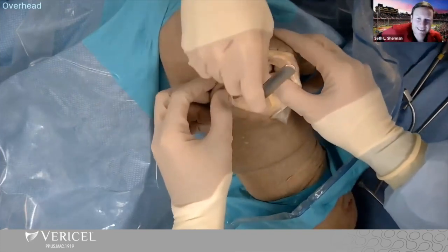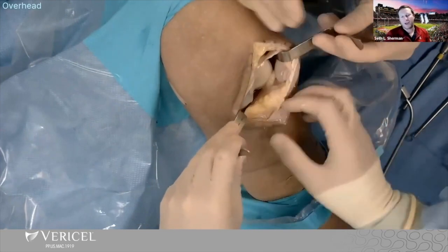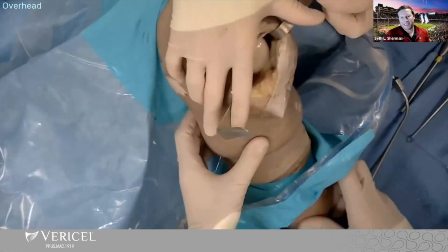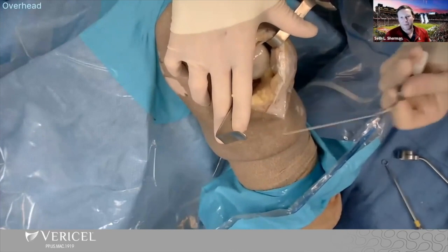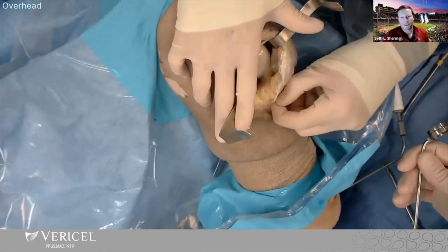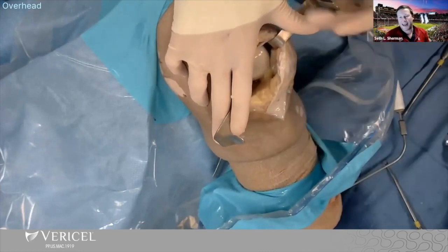For a lot of these I'm accessing them through a lateral retinaculum lengthening type approach, particularly if combined with a TTO, and keeping that TTO on the hinge will give you the easiest access. Of course, when you're doing this without TTO you have to be a great surgeon to get the exposure you're about to show us. Tell me about the fat pad — any tips or tricks to get that out of the way.